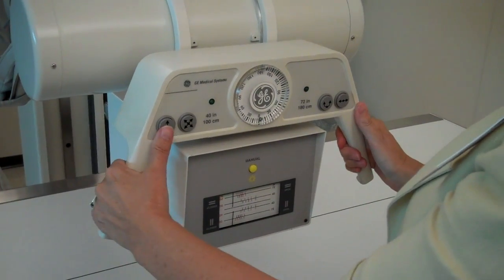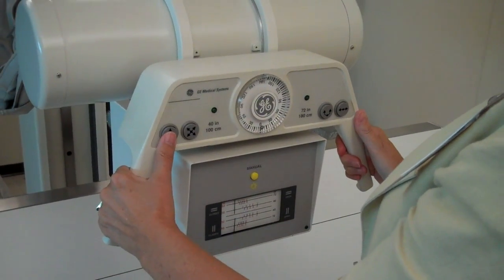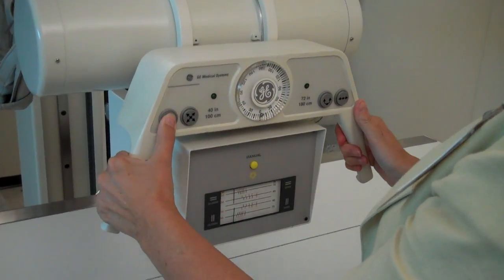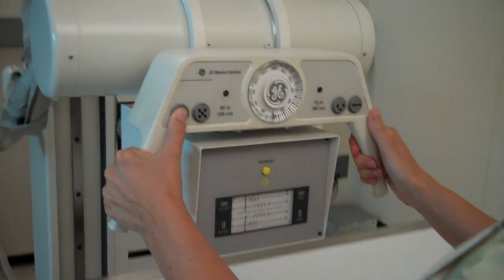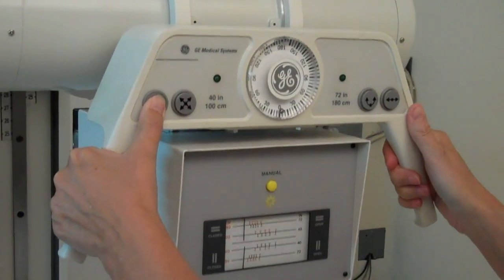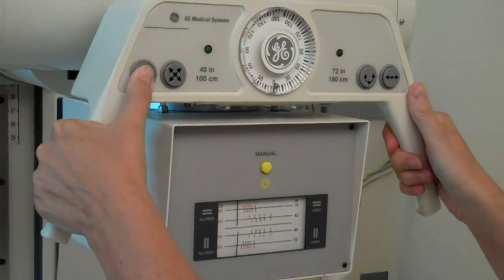In Lab A, on the tube head, we have buttons that allow for movement.